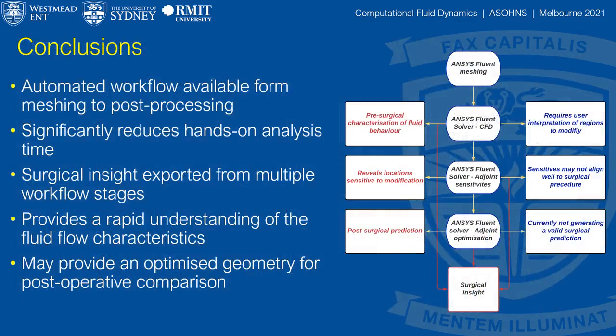An automation workflow is currently in development to reduce the required hands-on time needed to complete the simulation. CAD development and modification is currently a manual process and requires experienced personnel to ensure accuracy. Consequently, this process requires significant time investment. As meshing, simulation, and optimization are within the same software package, this workflow has already been developed to satisfy the analyzed septal deviation model. However, further work is required to generalize the workflow for additional models.